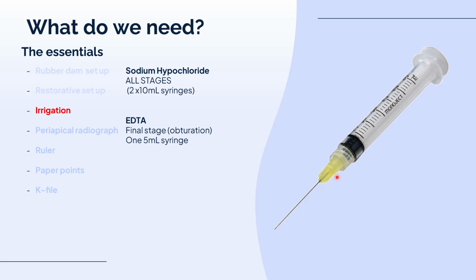So you get your Luer-Lock syringe and you get your 10 ml syringe. Okay, this is only a 3. Anyways, get a 10 ml syringe. And then I like to get the DAs to put a little bend in that and then put the cap back over it, just to help me sort of get it into the tooth and irrigate.